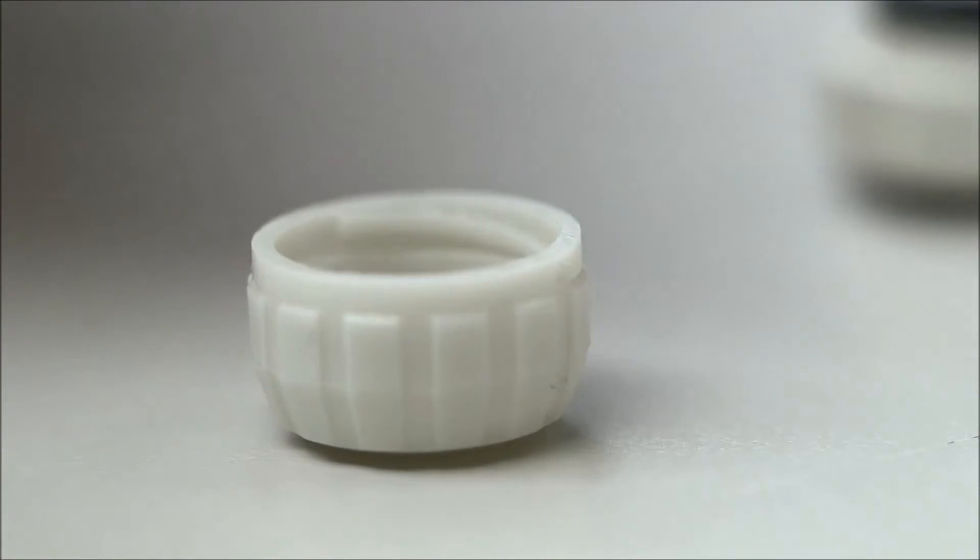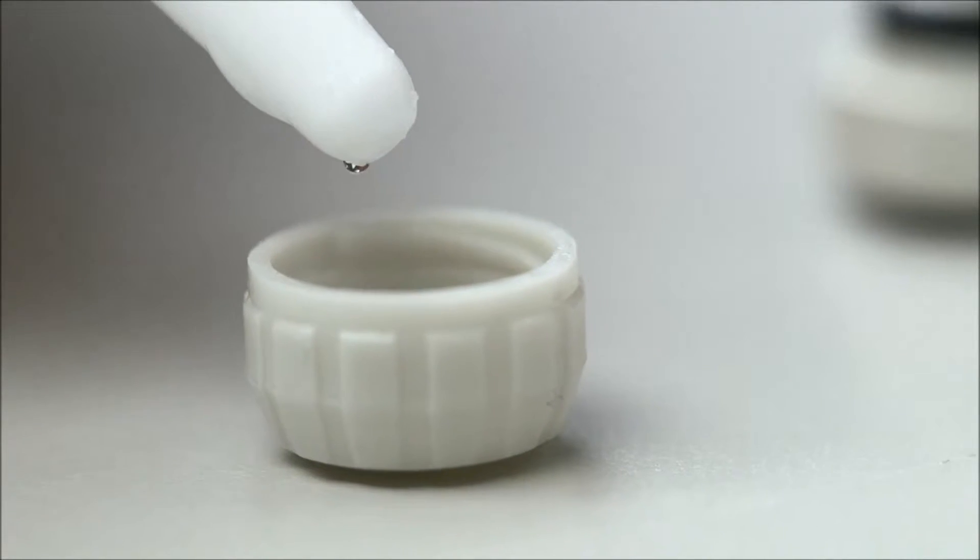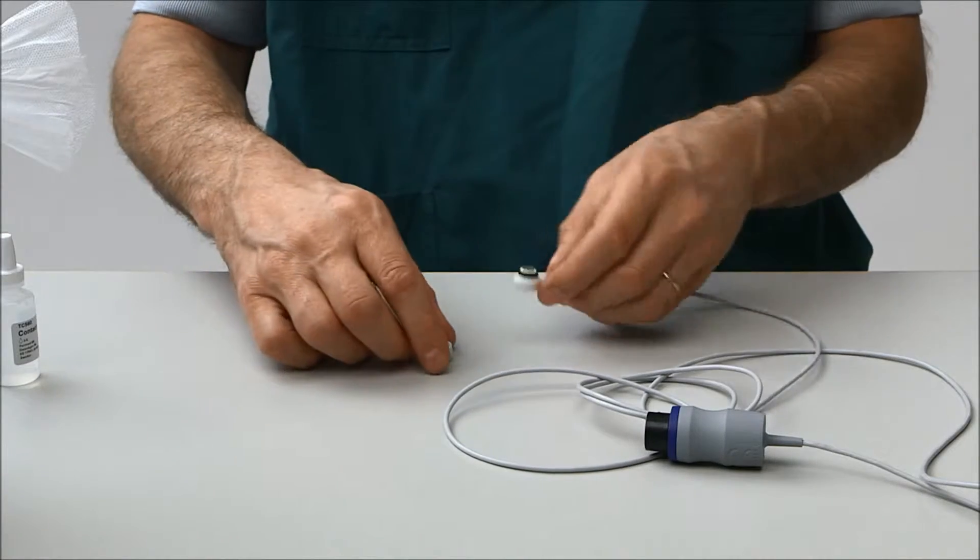For longer storage, put several drops of contact liquid in the protective cap before placing the cap on the electrode.